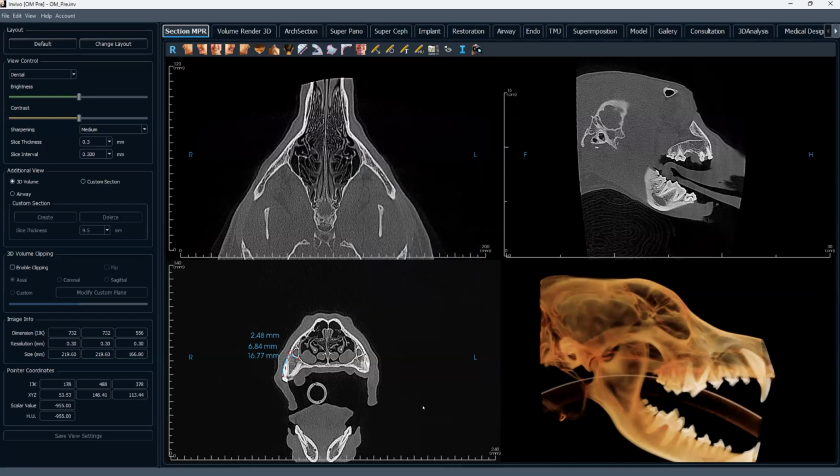Our workstations actually are in a central doctor's office that looks at all of our operating tables. And that's set up with computers that have graphics cards and big processors. So we do all of our reading in at one office station. And then we export these gallery images as JPEGs onto a server, and then we can pull them up chairside at any of the 4 surgery tables that we have in the hospital. So that's how we deal with managing the images. We only open the studies once, we work on them in one place, and then we export all the images and go through them as single images, and it's much easier that way.